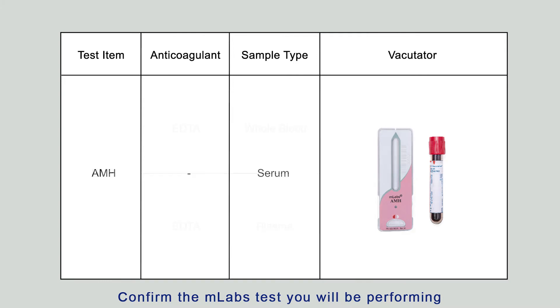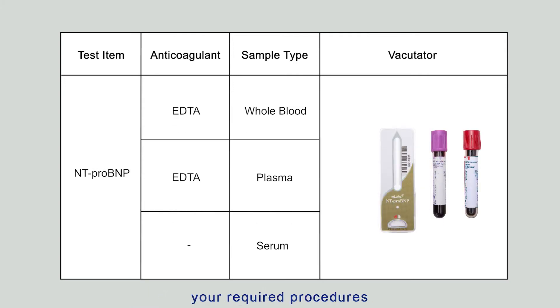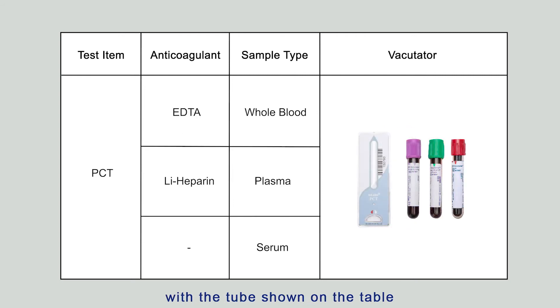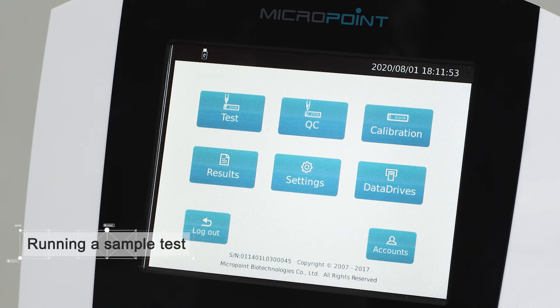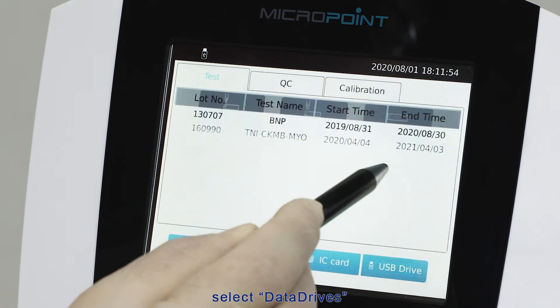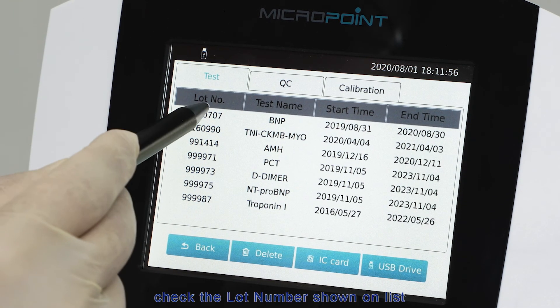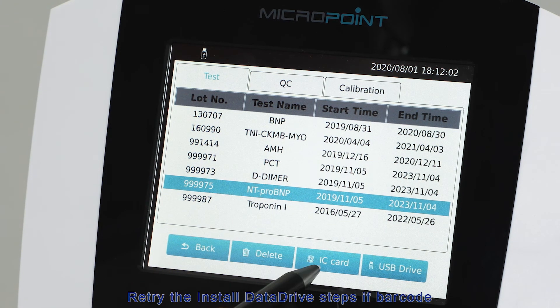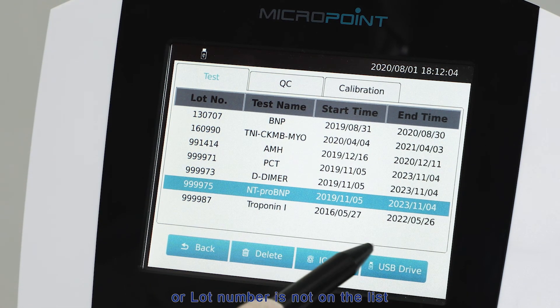Confirm the M-Labs test you will be performing and collect patient samples per your required procedures. The following chart highlights the validated collection tubes for each test — always collect samples with the tube shown on the table. Prepare the cartridge from the cartridge kit and prepare a fresh test sample. Ensure the test data drive is correctly installed — from the home menu, select Data Drives and check the lot numbers shown on the list. Retry the data drive installation steps if the barcode or lot number is not on the list.